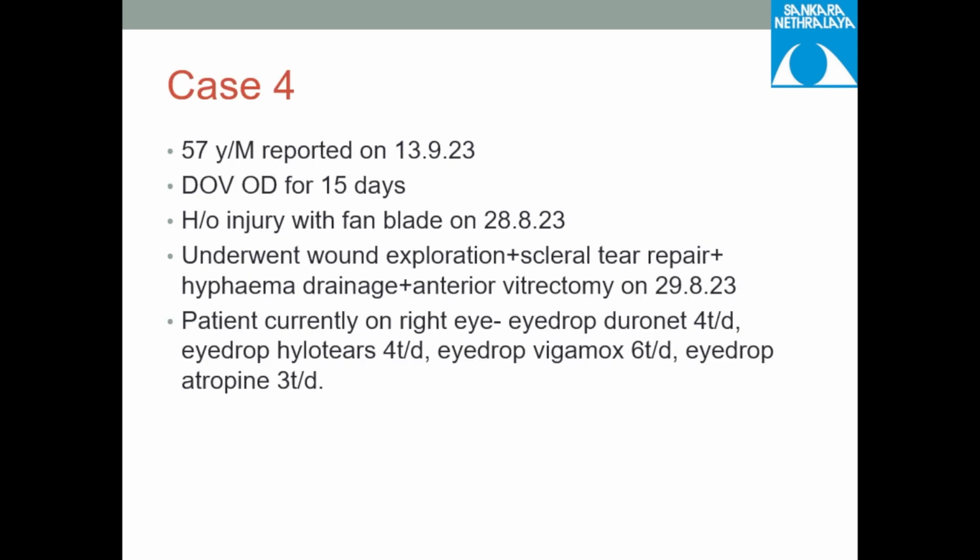It's always necessary to do that ultrasound because other foreign bodies are bound to be missed, or it might be somewhere in the pars plana, and if you don't remove it, it becomes negligence. Once you have gone inside, you have to completely rule out that there are no others. So for that reason, ultrasound needs to be done.